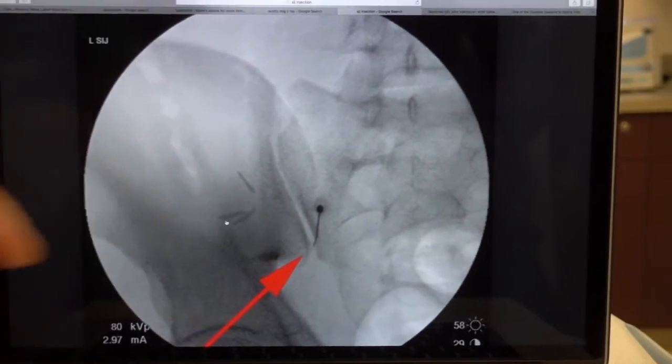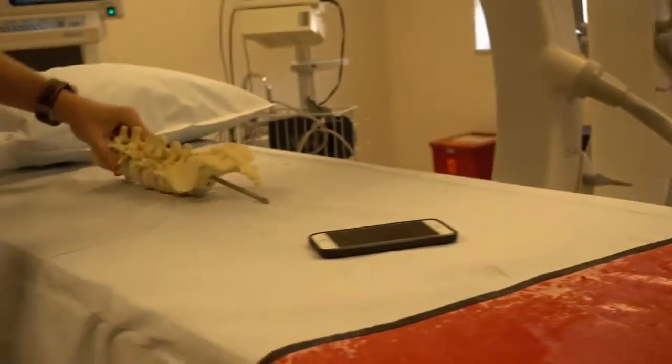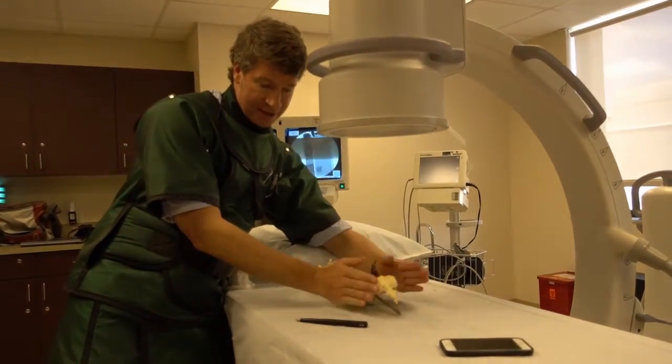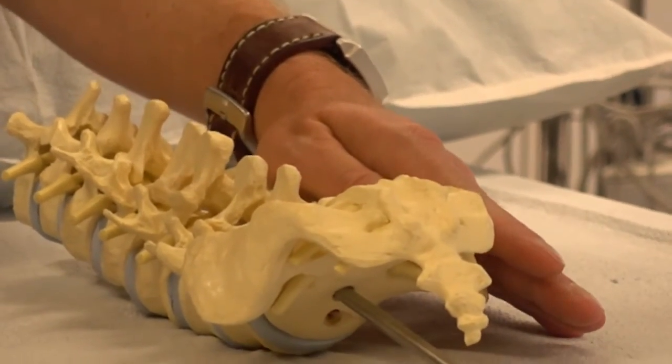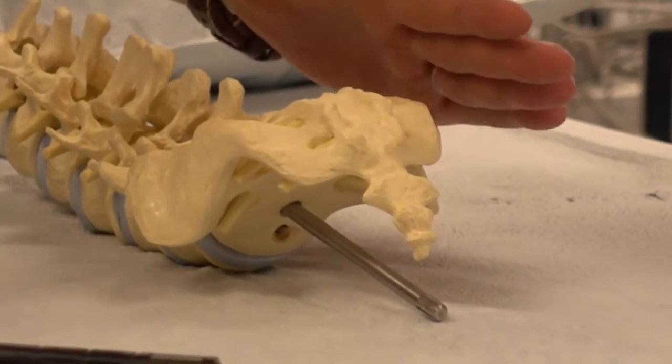Generally speaking, what will happen is we'll toe a little bit, like we said, and if you can look over here, Helene. Because of that angle of the joint, it's not like this. It's like this. So we'll start with a little bit of angle just away from that joint. Let's say we're doing the right joint. The patient's looking down.